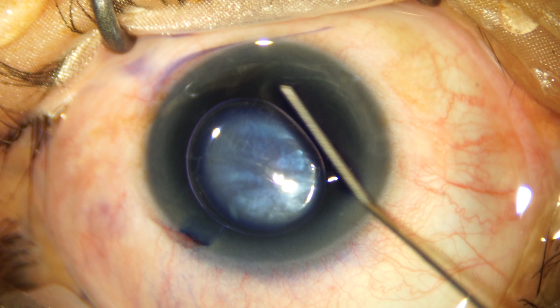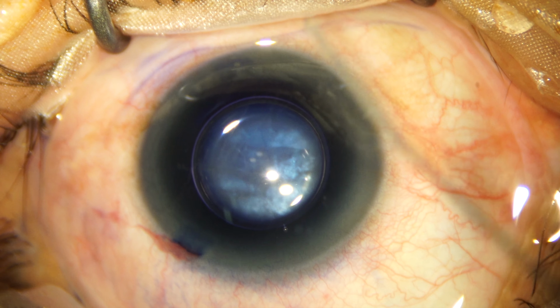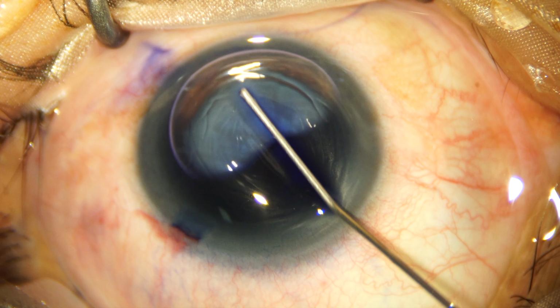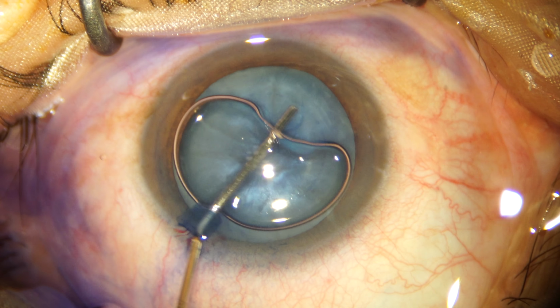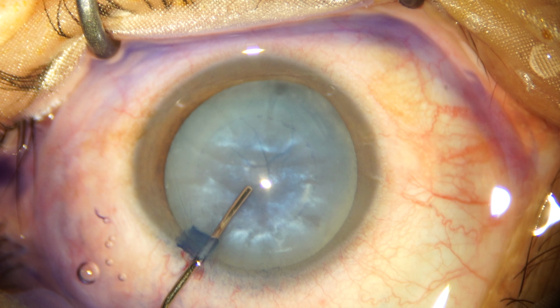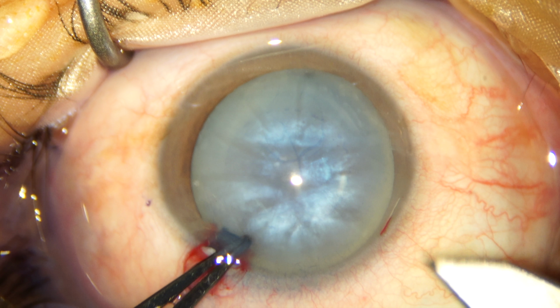I find the massaging bubble technique very convenient in staining the anterior lens capsule because it evenly spreads out the dye over the anterior lens surface. For mature cataracts, my viscoelastic substance of choice is a cohesive one as it flattens the anterior capsule much better than the dispersive viscoelastics.